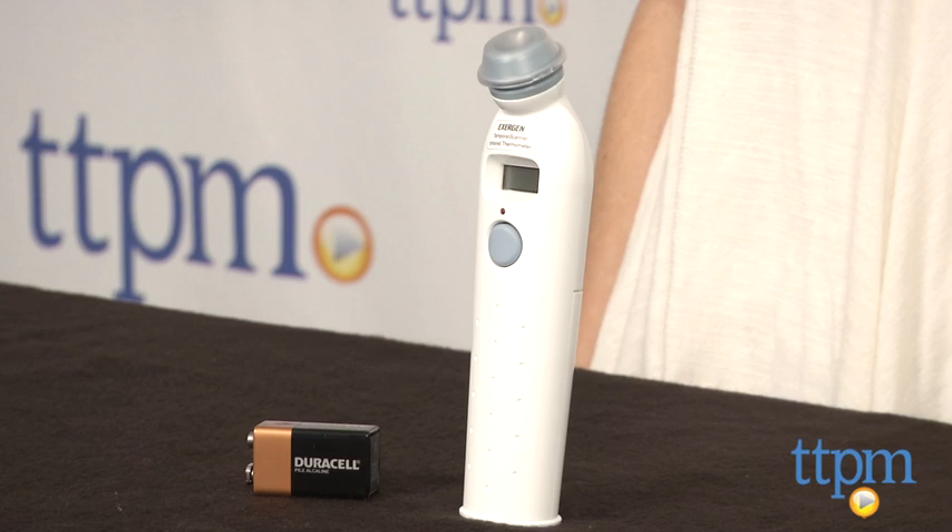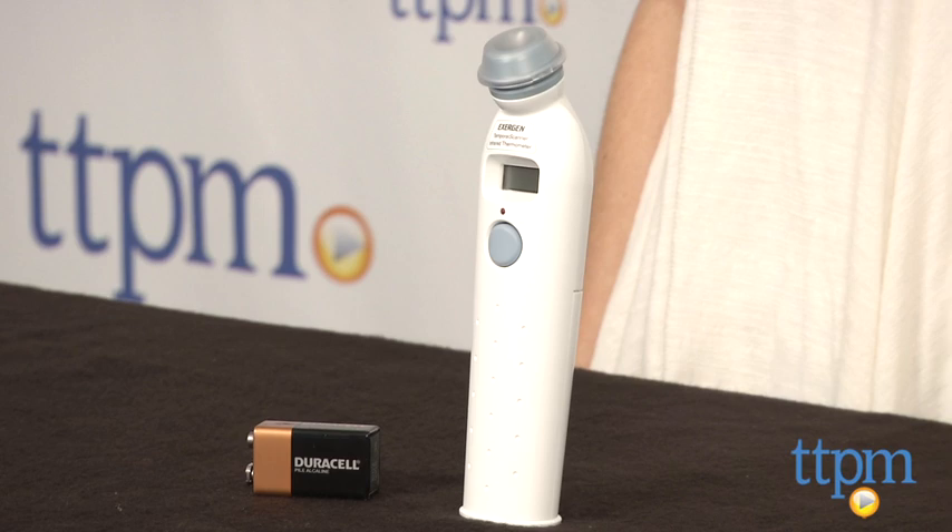One thing you should be aware of is that if your child is sweating and their forehead feels damp, there's an alternate way to use the thermometer behind the earlobe. For more information on this product and the best reviews online, visit us at TTPM or download our free app, Shop for Kids by Time to Play Mag.